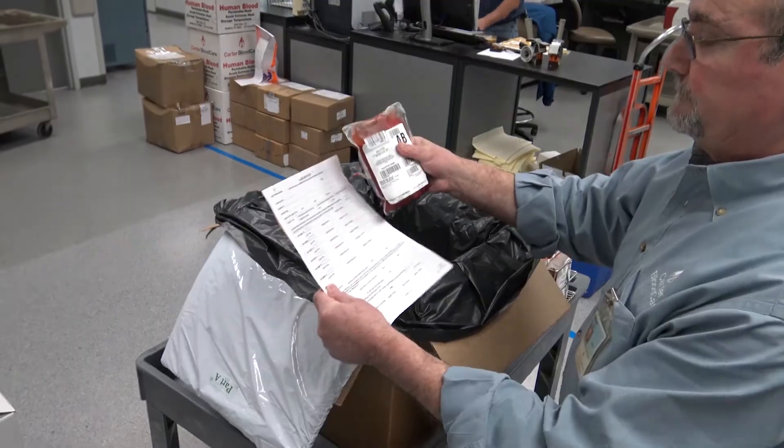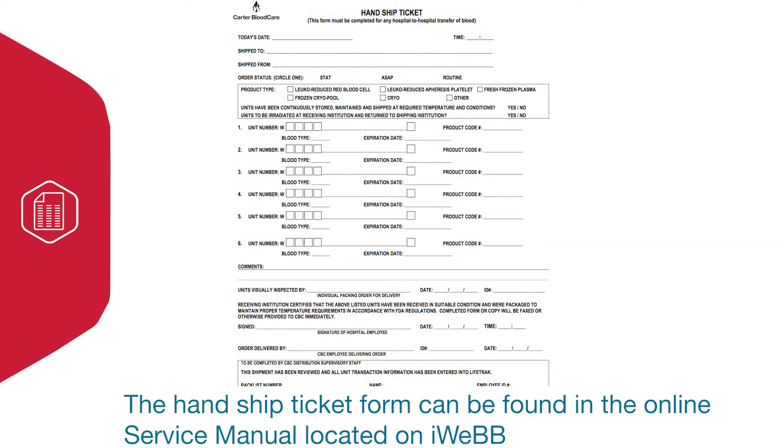Once you've assembled your packing materials, you can remove the red blood cells from refrigerated storage and begin the packing process. First, you're going to want to document the unit information that will go on your hand-ship ticket form. This includes the blood unit number, the expiration date, the product code, and the blood type.